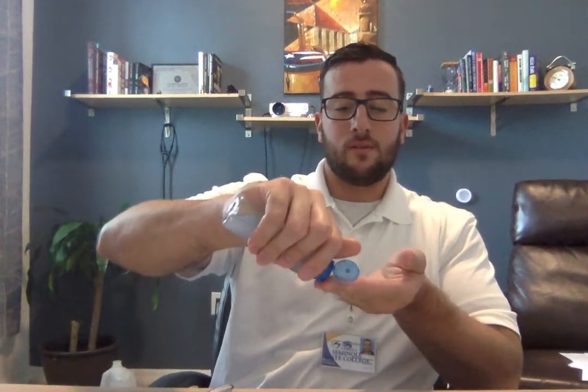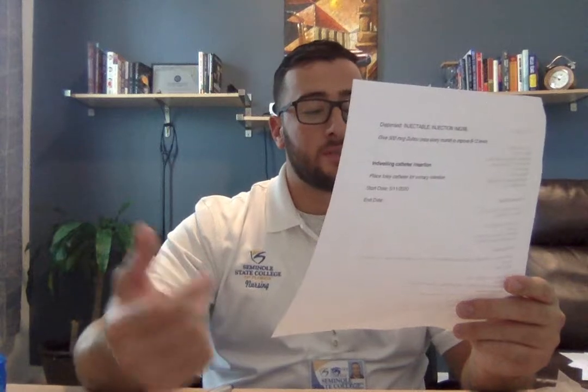Before I do anything else, I verified the patient. I'm going to sanitize my hands. So right patient, Anna Pavlovsky. Right drug is going to be the influenza vaccine. Right amount, 0.5 ml, which I already have here. Right route, intramuscular, I'll be doing the deltoid muscle. Right time, so it's 5/11 at 14:58, which it is now, and I'll document.